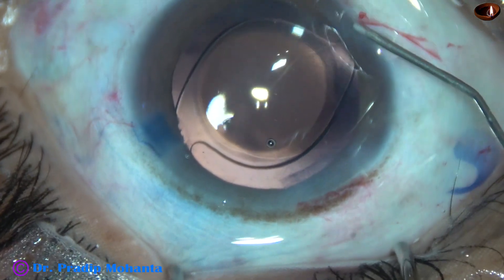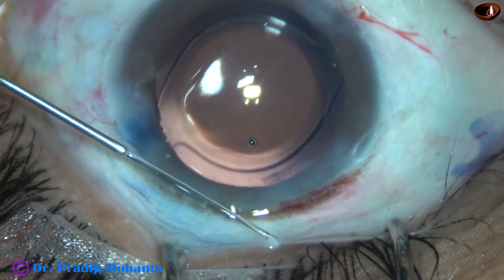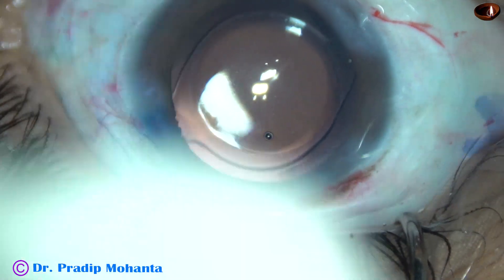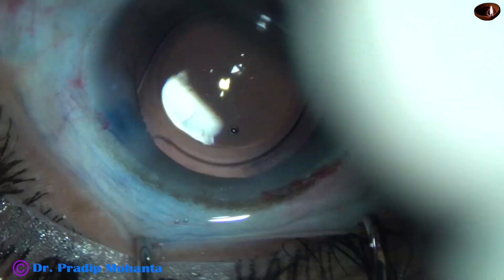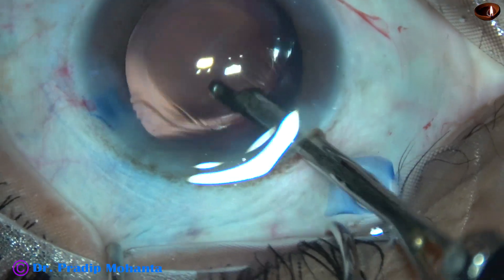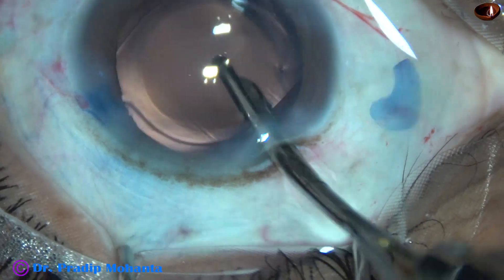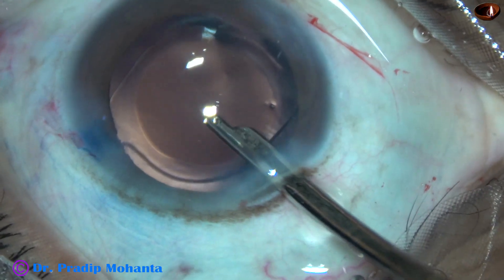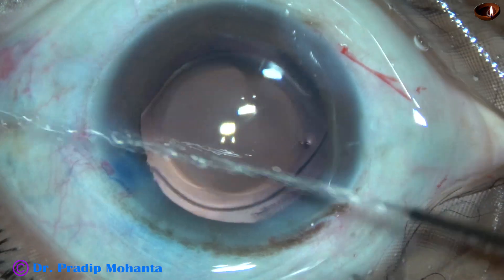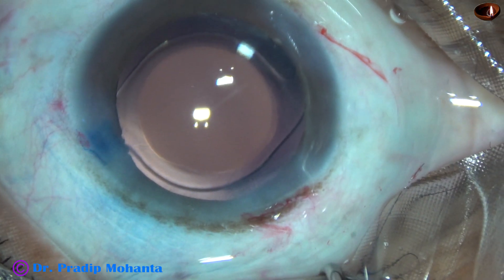Now the side ports are closed by hydrating the corneal stroma on either side of the stab wounds. This is a totally unedited surgery and you are watching the full surgery. This is the final lavage of the anterior chamber. I prefer to do this with a 23G Simcoe because I can clean the viscoelastic sticking to the posterior surface of the cornea — that is, from the corneal endothelium — very gently, and I can form the anterior chamber very nicely.